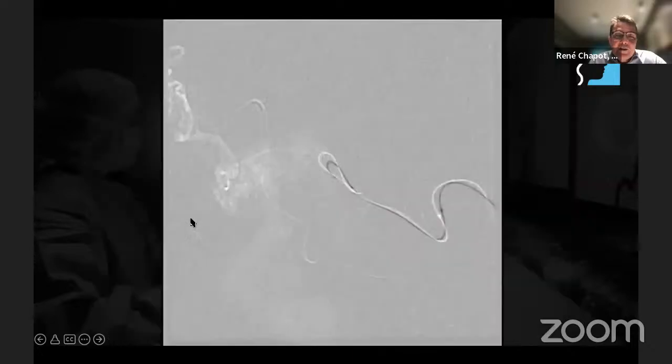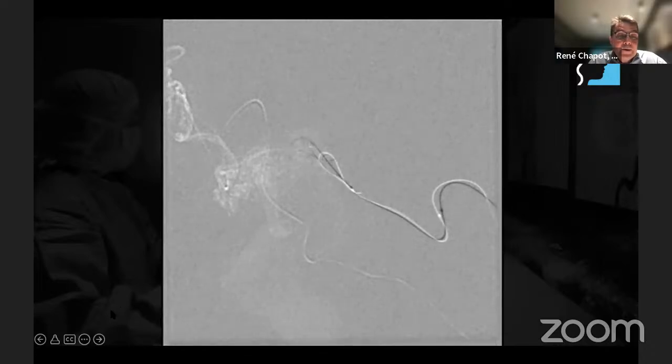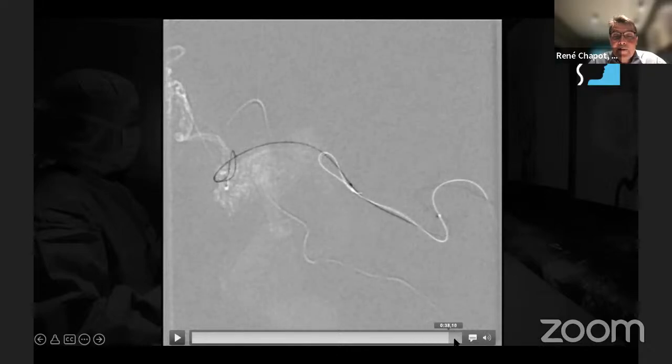Here it was before we were doing those imaging modalities. You guess that you must reach here. You look at both planes. And here's a navigation with the wire, where at some point you may see that it was possible to make it a bit more accelerated. Here, the wire was going to the shunts, but at some point here, you see that we're about to reach the artery that we could not get access to.